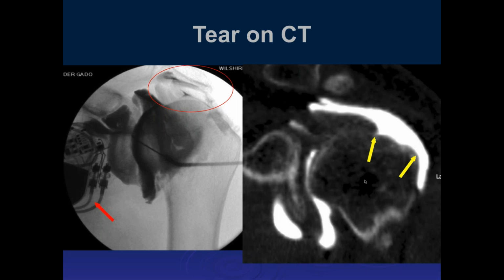It actually depends on the specific electronic device, and has to do with the frequency of the RF that occurs. Some devices handle the higher frequencies better than lower frequencies. But the bottom line is that in most cases, there's not really a clear difference between high field and low field when it comes to risk for electronic devices. Got it, because they're in the scanner longer. They can be. Thanks.